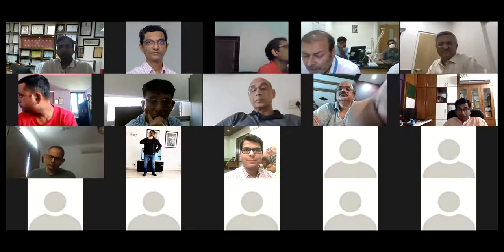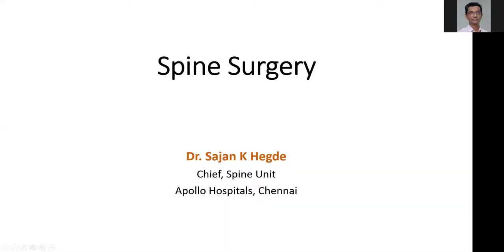The presentations from Bhavok and Ajoy were absolutely excellent, and they addressed quite a few things that we can do with the ultrasonic scalpel. I just wanted to add to Bhavok's presentation that when you start using the ultrasonic scalpel, you have to be very, very patient. There is no place for aggressive movements. You use the tool like a paintbrush, and when you use it like a paintbrush, it's an extremely versatile tool.